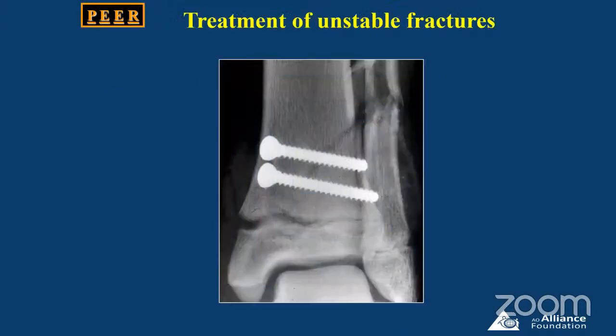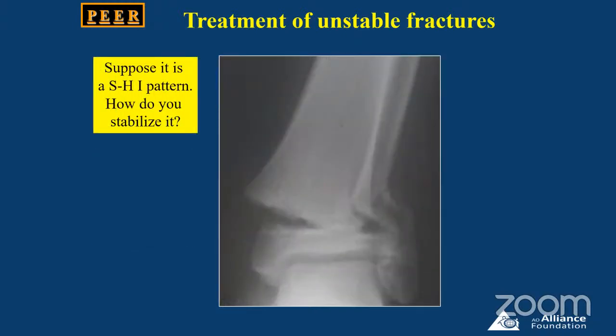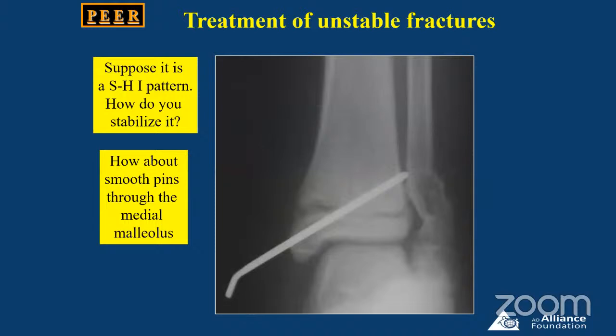and after it is reduced, if it is unstable, metaphyseal screw fixation if the Thurston-Holland fragment is big enough. You can see the medial gap. Sometimes you may get incarceration of the periosteal flap. Okay, so that may require attention. Sometimes you may not get the reduction. So what you do is, a smooth pin, if you need to pass, you always aim for the center of the epiphysis, so that you don't cause an angular deviation, and remove it in the shortest period of time. The fibular fracture, again, as I said, is metaphyseal or diaphyseal and need not be treated.